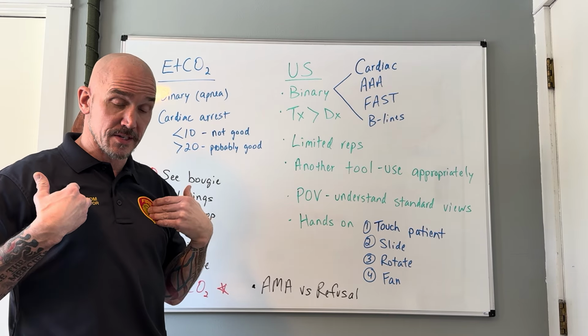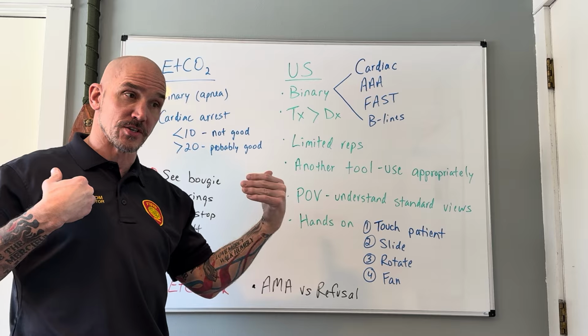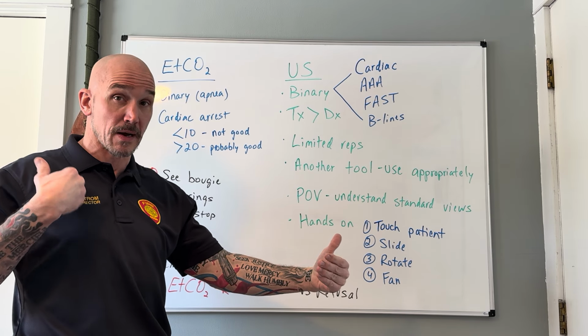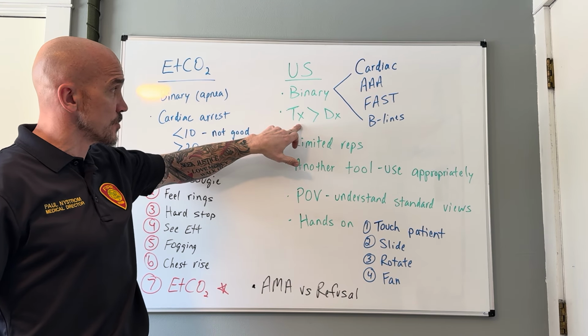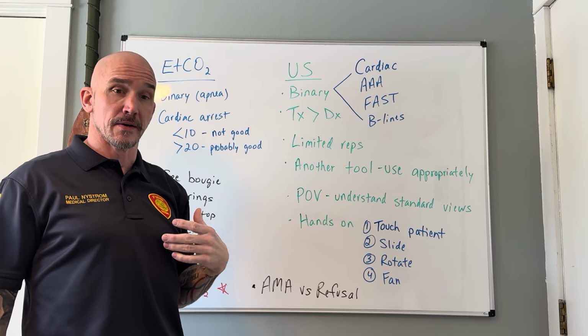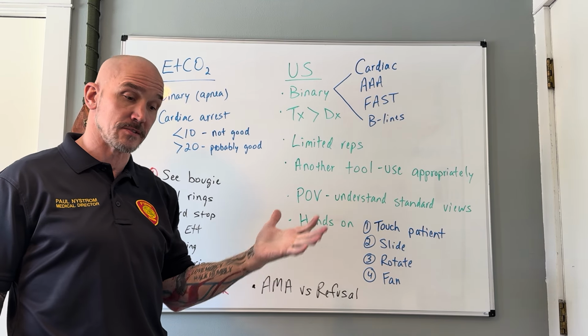If you can get a look and see, okay, we're probably on the CHF pathway, I see tons of B lines, even though the patient has both CHF and COPD, we're probably on the CHF pathway, right? Which speaks to this other point, treatment comes before diagnosis, right? CPAP is a treatment for really sick patients with either COPD or CHF, as an example.